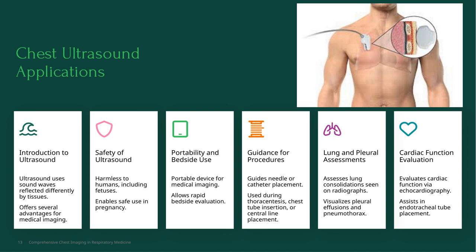Finally, a quick note on how ultrasound works. It uses sound waves reflected differently by various tissues to create images, offering several benefits over other imaging modalities, such as safety, real-time imaging, and portability. All these features make chest ultrasound an essential part of respiratory medicine, helping us diagnose and treat patients more effectively and safely.